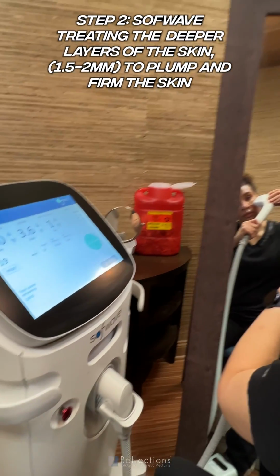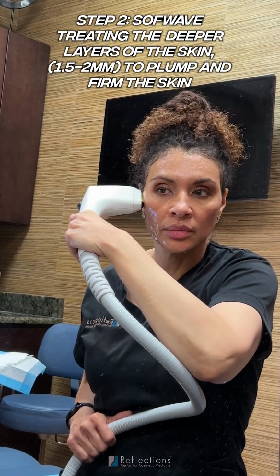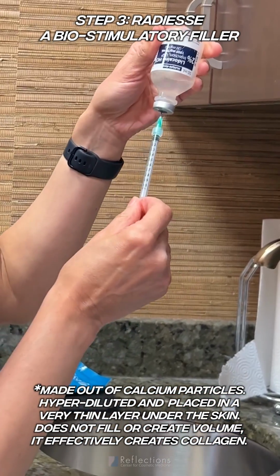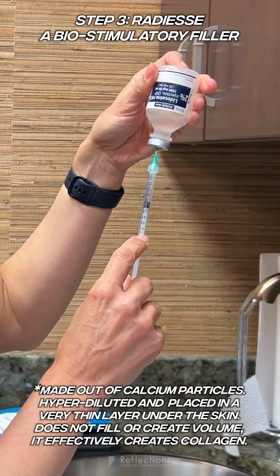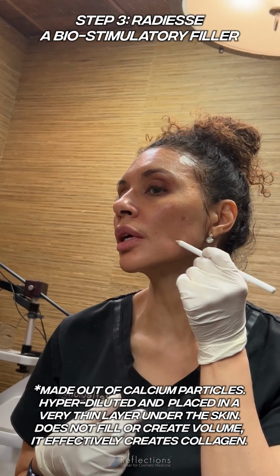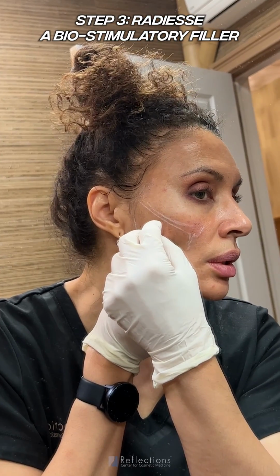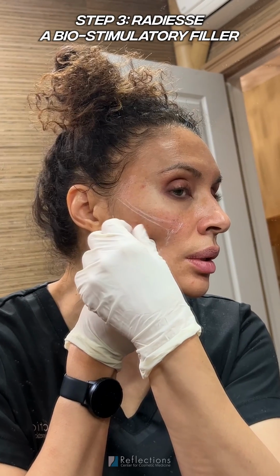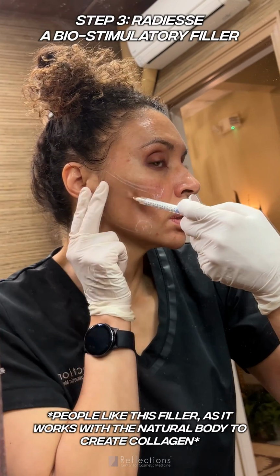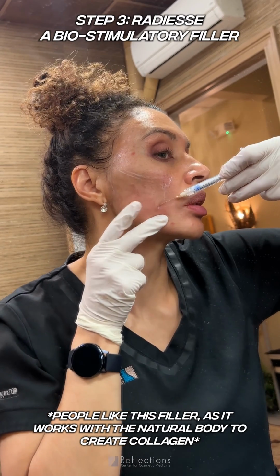So this one is a skin treatment. The other one was the muscle treatment. I'm going to start with the Radiesse, and then we will mix it with a little bit of lidocaine. You always look for where the gel is because you do not want to add to that. You have to be careful because there's a big artery right here.